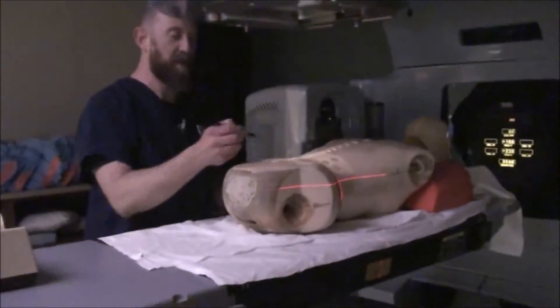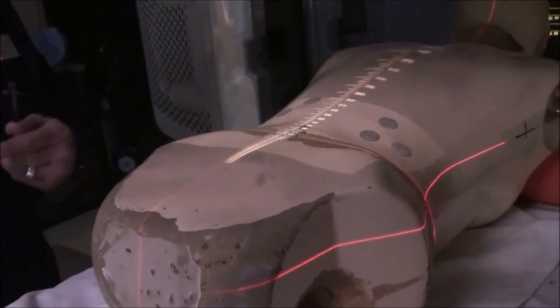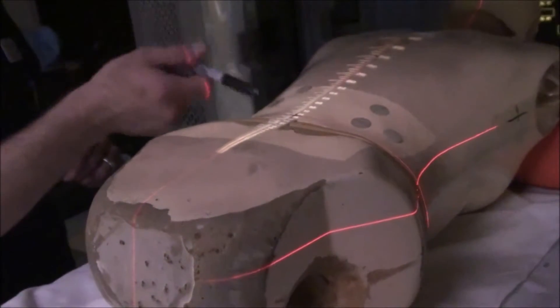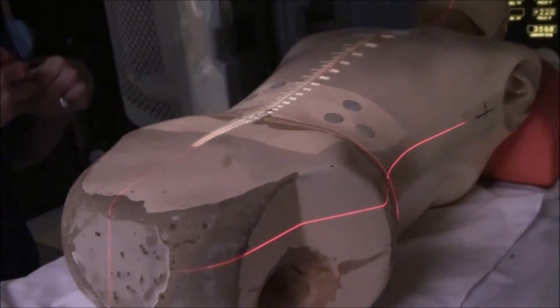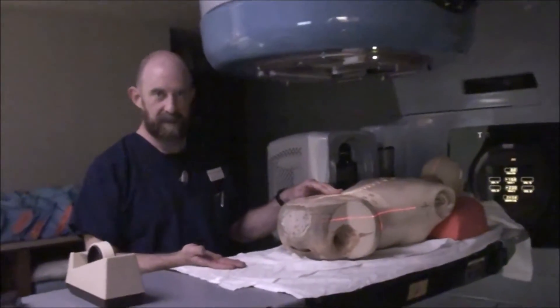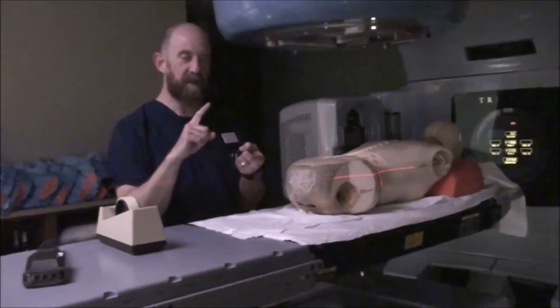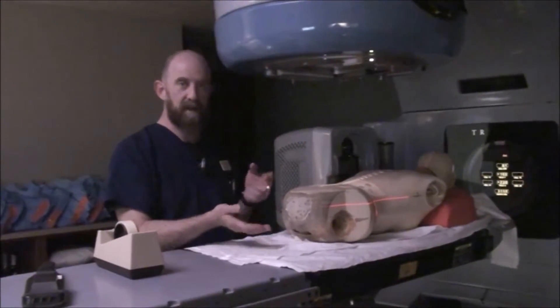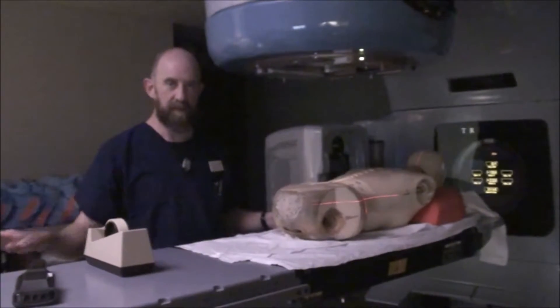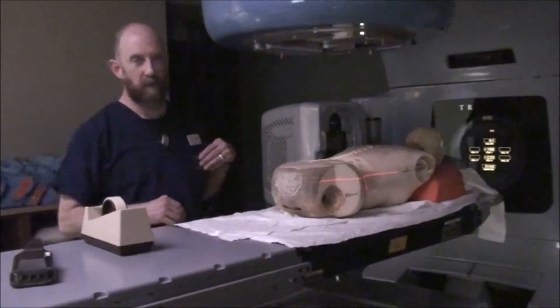Mark your patient before they have a chance to move, then double-check your SSD. If the patient was moved in or out, the SSD could have changed due to the slope of the patient. Double-check it and make sure it's exactly where you wanted it. Once confirmed, put your film in, set the image intensifier, center your eye, set the correct TFD, put a marker on the film, and take your film. Once the film is run, get it approved.